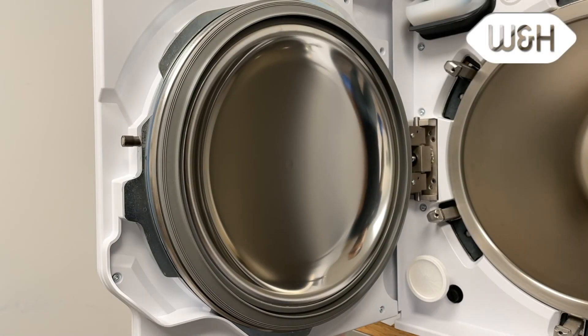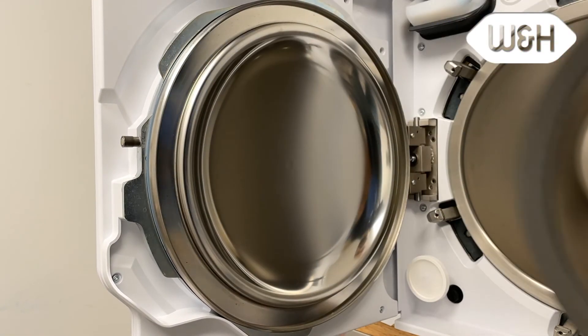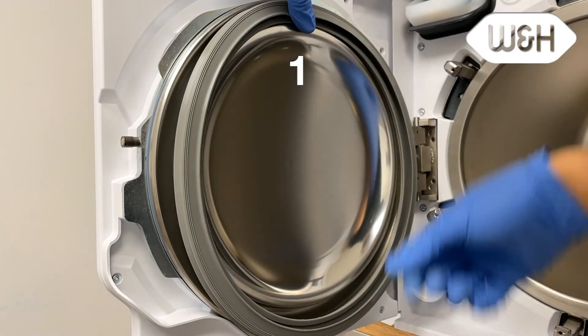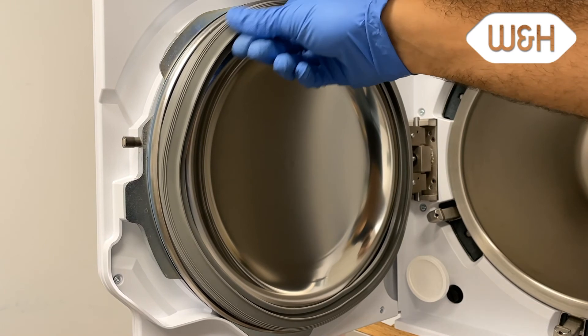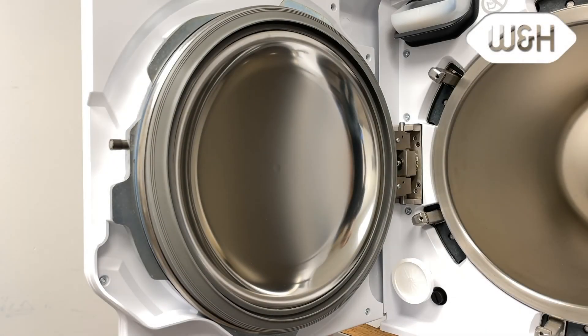To replace the used door gasket, remove the old gasket off the chamber door. Mount the new gasket starting at the 12 o'clock position, then 6 o'clock, 9 and 3. Ensure the door gasket is properly mounted, fully seating into the groove. A door gasket not fully seated can cause steam leaks, sterilizer malfunction, and even personal injury.